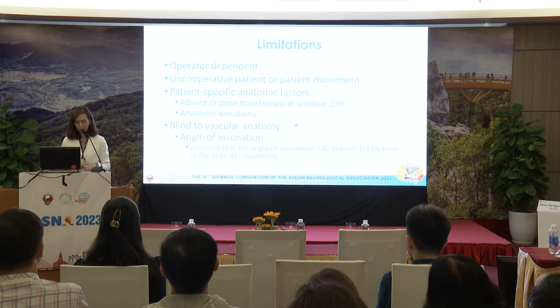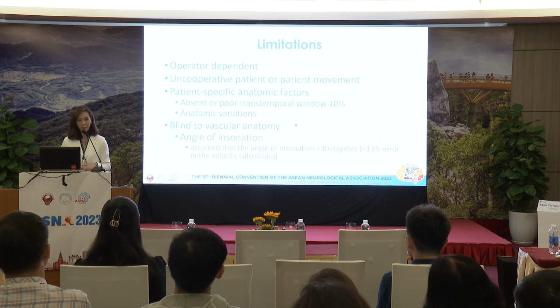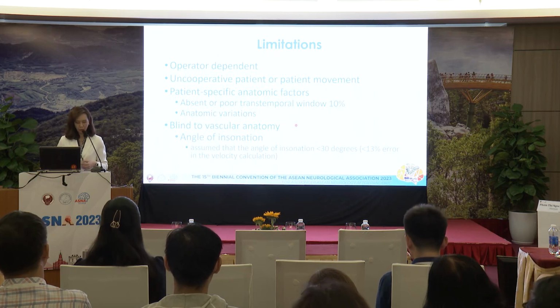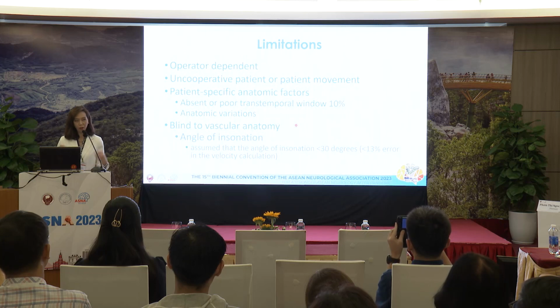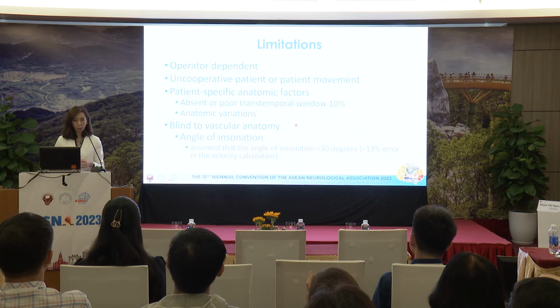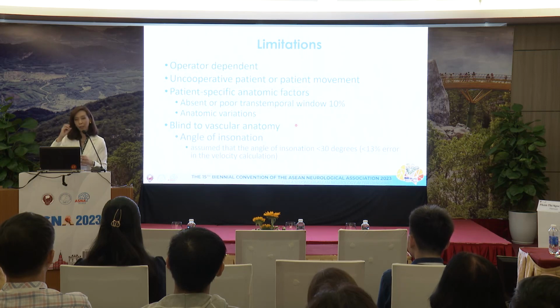There are some limitations. Of course, it's operator dependent. We don't see the arteries, so it depends on you to define the arteries. And in patients who are not cooperative, who are moving around, it's maybe not very good. And there are some patients with anatomical factors which do not allow us to find the arteries.